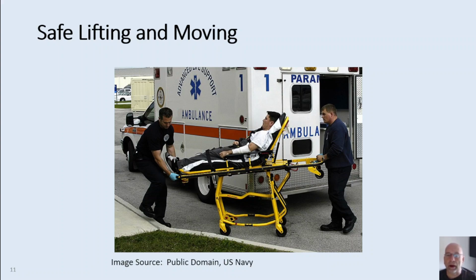Whenever possible, a spotter should be behind them and should have a hand on their back or grasp their belt to keep them balanced. When lifting or moving a patient, the provider at the head is generally recognized to be the one who provides a countdown prior to initiating the move. Clear communication is a must to ensure that all team members move together as a single unit.